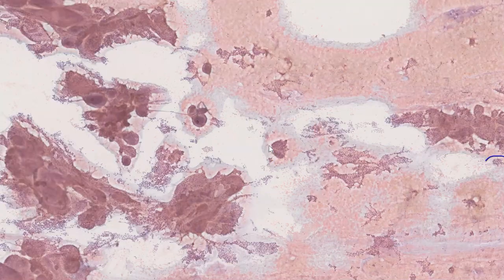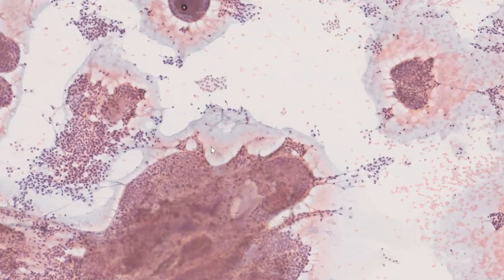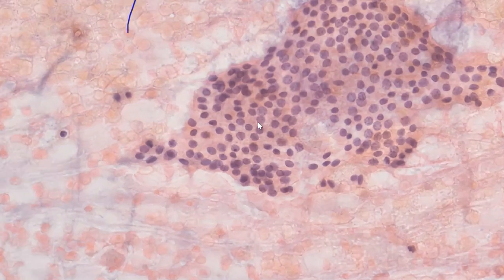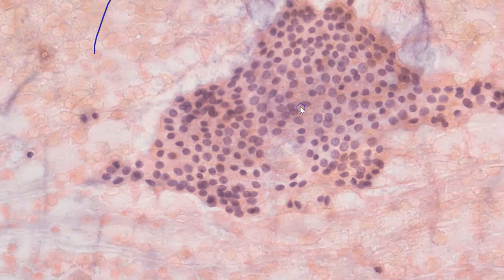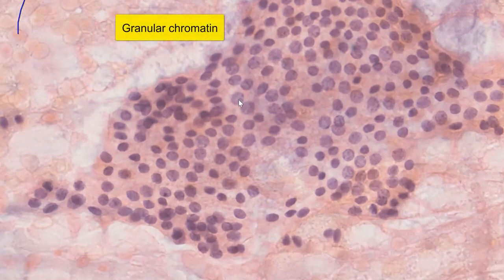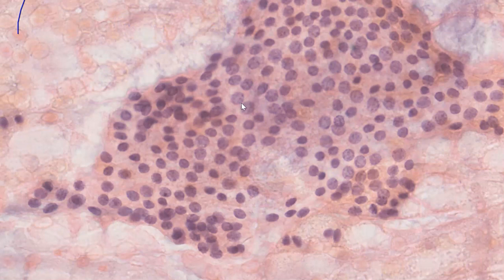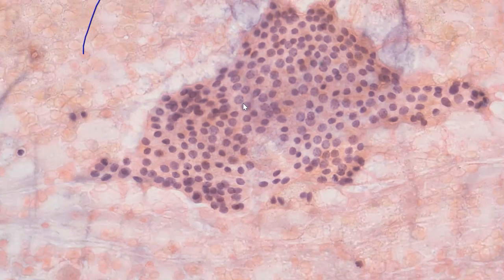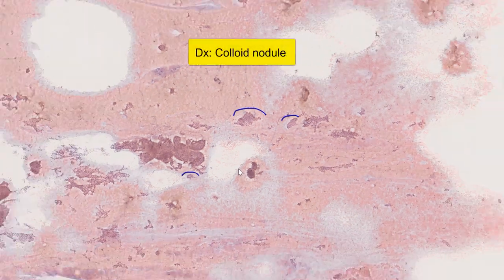Colloid can appear variable in color in the alcohol-fixed smears. Here you can see it's a little bit orangophilic; over here, it's just pale blue-gray; sometimes it can appear greenish as well. Focusing on this very nice honeycomb sheet of cells, you can again make out that the nuclei are quite small relative to the red blood cells, and you can just about see that there is granular chromatin. This is very reassuring and is in contrast to the very pale and powdery chromatin that we would see in papillary thyroid carcinoma.